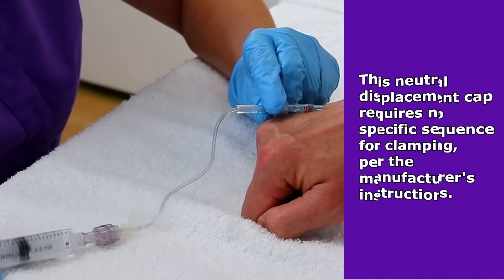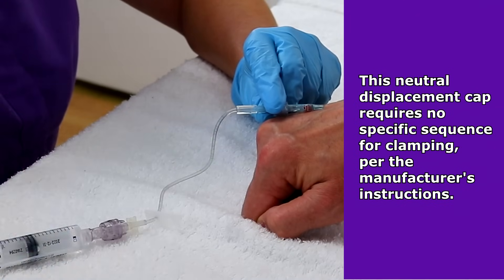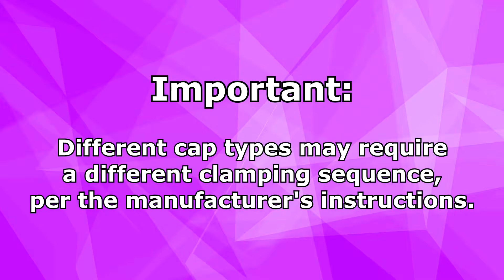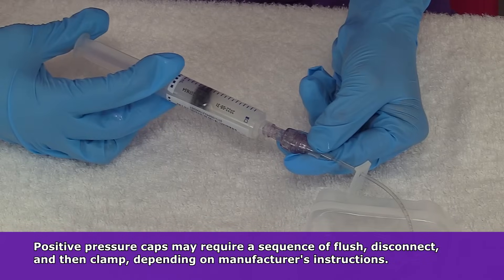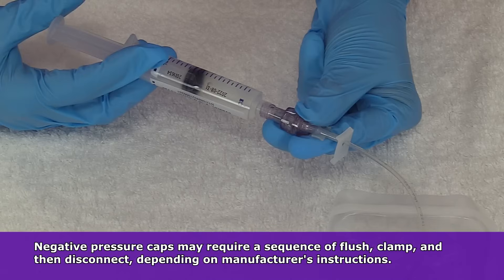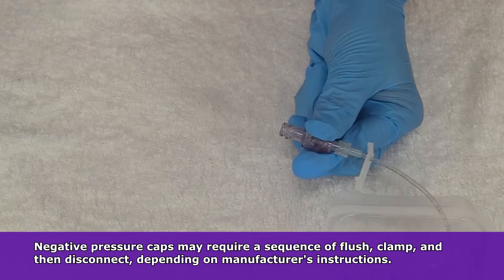Because we're using a neutral displacement cap there's no sequence required, so I'm just going to clamp it off and undo this. But if this were a positive pressure cap, it would change my clamping sequence — for instance, I would flush and then disconnect from this cap with my flush and then clamp. You can also have a negative pressure cap, and with those you would flush, then clamp, and then disconnect. So just be familiar with the type of device you're using.